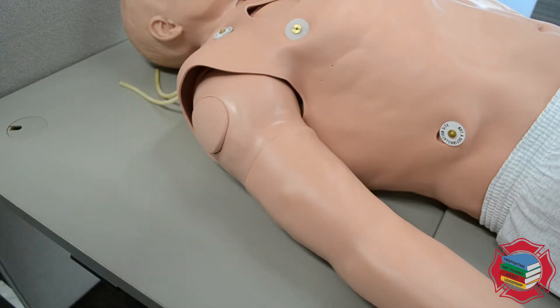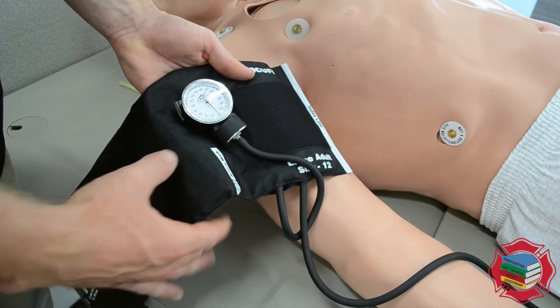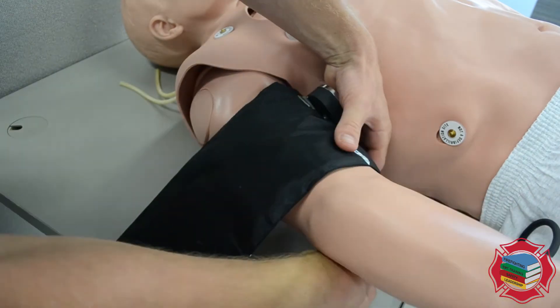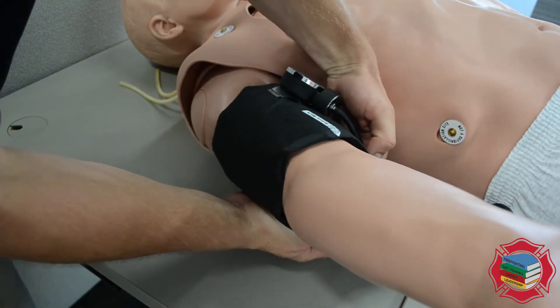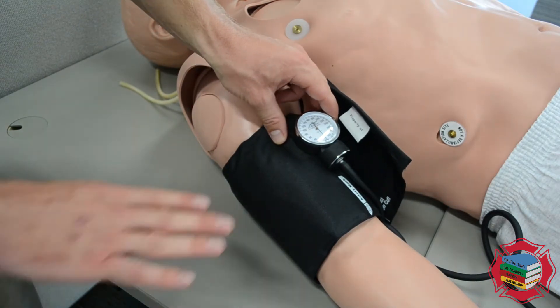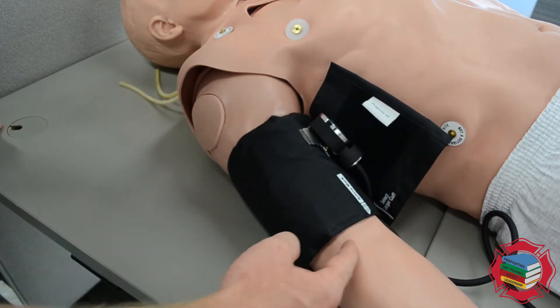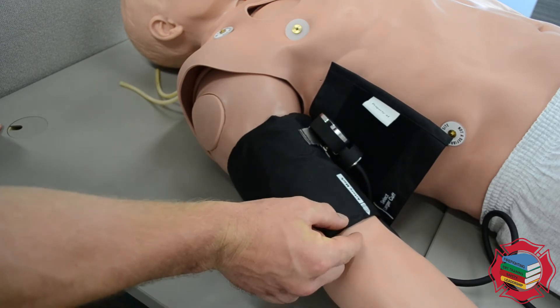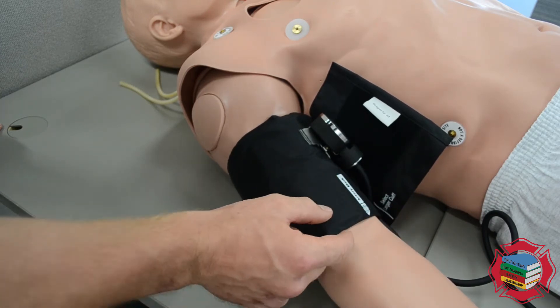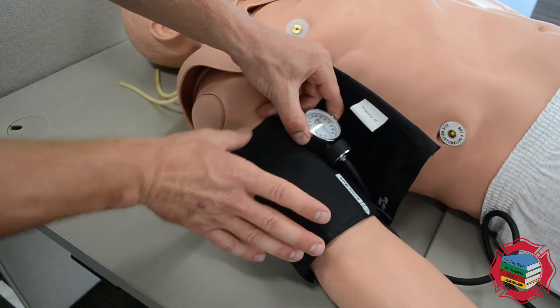When applying a blood pressure cuff to a patient's arm it's important that you use the artery mark. Since we're applying this on the upper arm, we will line this up with the brachial artery, which is just medial to the bicep, and then wrap the rest of the cuff around the patient's arm. The crease of the elbow is about here, so we've got about an inch above that crease — the antecubital space — so that we can fit our stethoscope there when we take an auscultated pressure, allowing better coverage of that artery by the bladder.